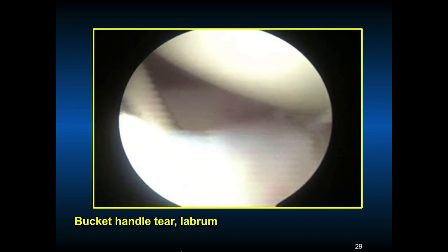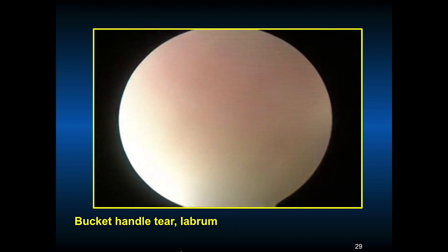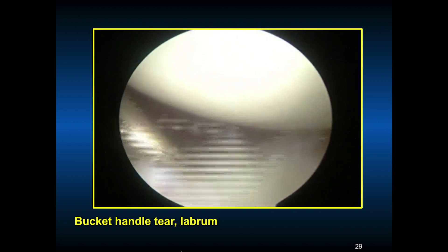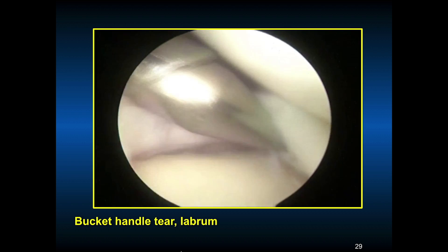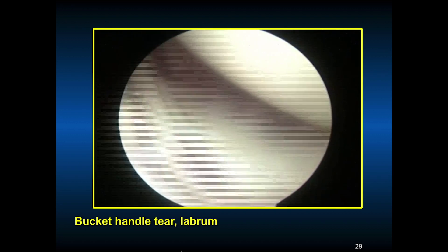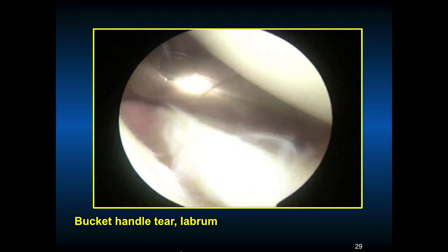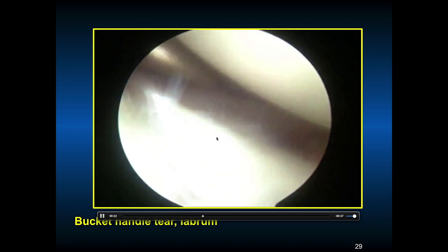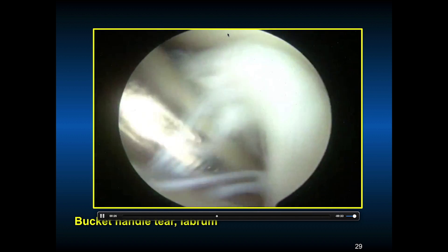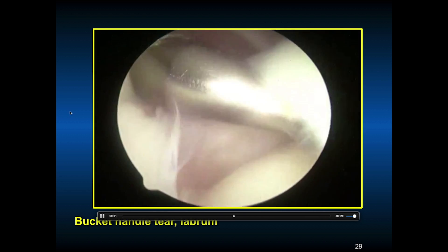This is his arthroscopic picture. He has a bucket handle tear of his labrum, which developed over the course of his chronic recurrent dislocations and throwing. This is unfortunately very difficult because it's chronic — you can see the tissue does not look the best. The subscapularis is visible in the anterior aspect. The scope is in the back in lateral decubitus position. The humeral head is here and the biceps tendon is up on top.